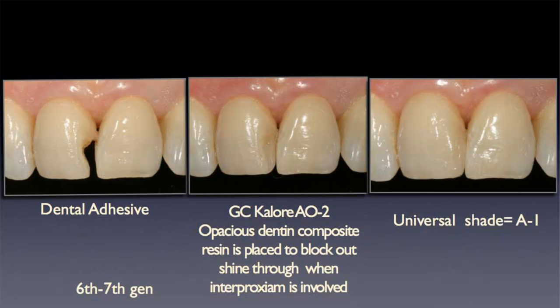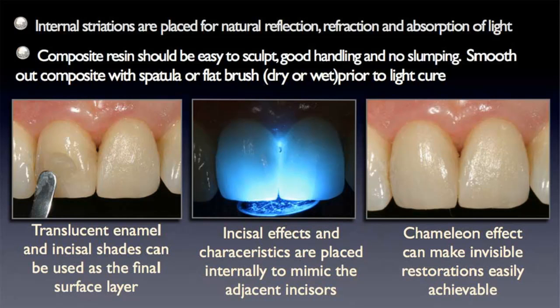And then I'm going to use, which I don't show here, a flat artist brush to be able to create the best smoothness possible and create good anatomy as well as good surface texture prior to curing, so it'll help to eliminate the amount of time that's needed for finishing and polishing.